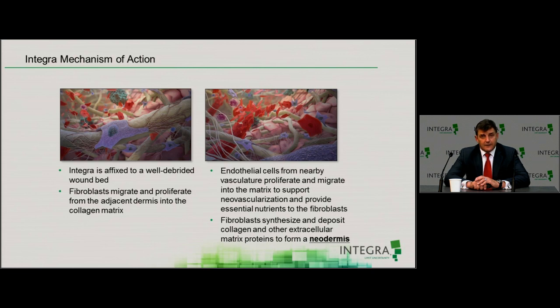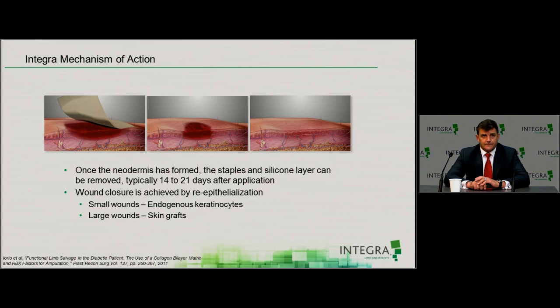With that in mind, we'll use something like a dermal regenerative template pretty quickly after major resection. Many of our patients who had major foot resections for diabetes mellitus, severe infections, or post-trauma, we really try to speed along the regenerative process with early application of IDRT, sometimes in conjunction with other therapies that we use in the inpatient setting as well.